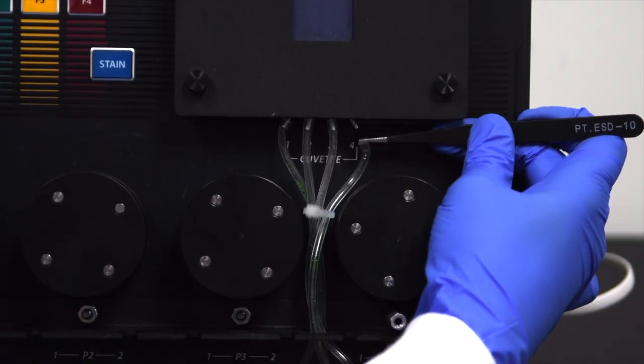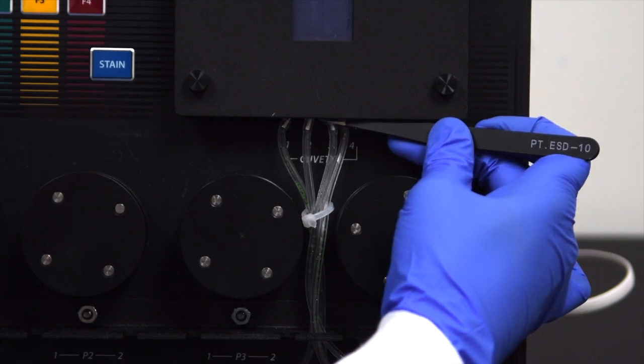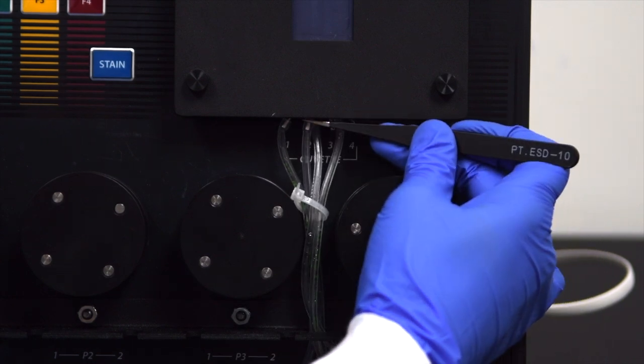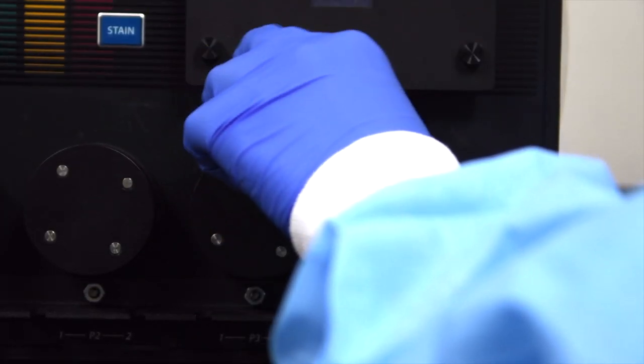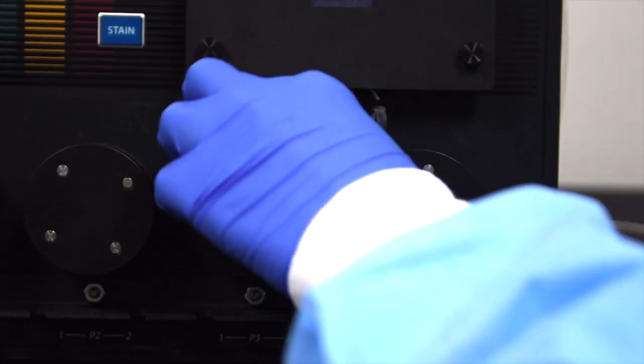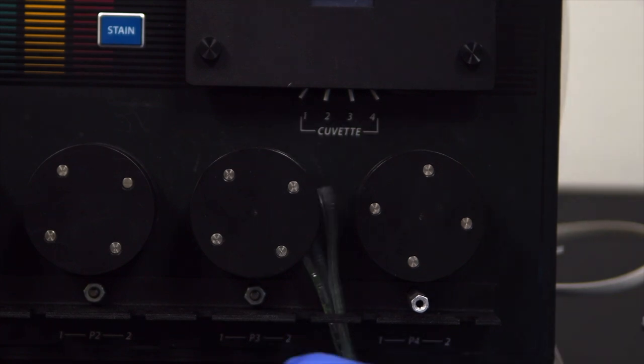Using a hemostat or forceps, pull the clear cannula lines straight down from where they are connected to the base of the cuvette chamber. Cut the zip ties that hold the clear cannula lines in place, and completely remove the tube kit from the machine.